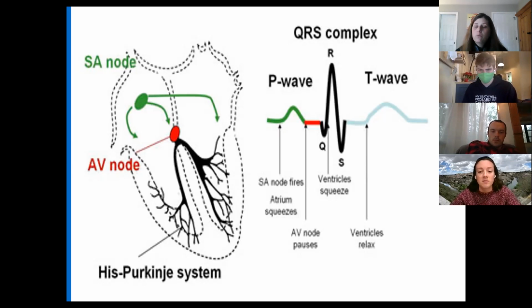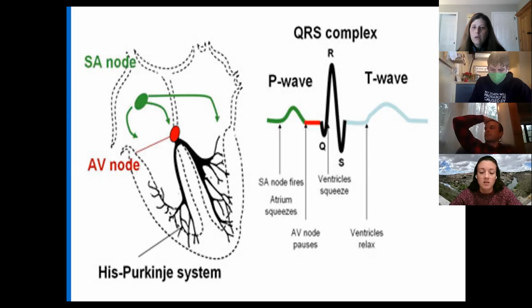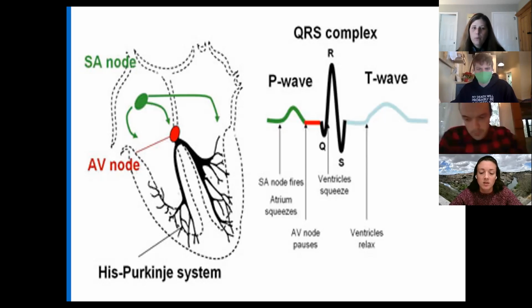They're trying just to breathe for a second. It's not even a second. It just happens so fast. Listen to your own heartbeat. You know there's not a full second between it. It's just ever so brief, and those ventricles can receive more blood and get ready for the next contraction, the next depolarization. Hopefully matching the places up in the heart with the EKG strip there helps you a little bit.